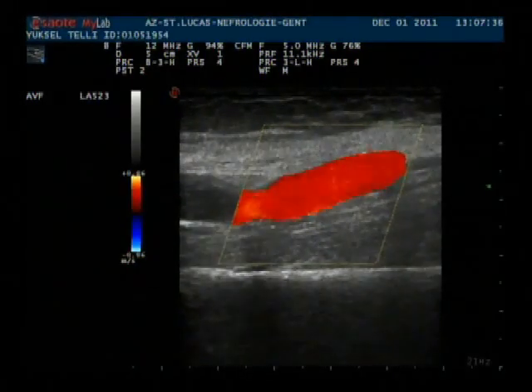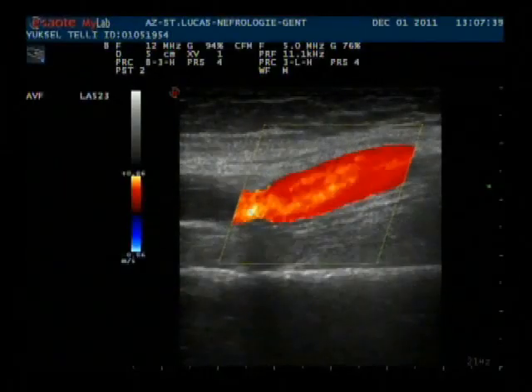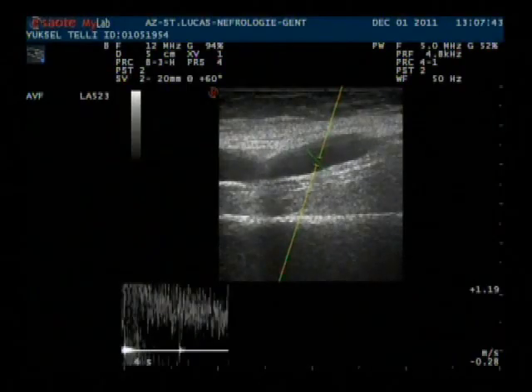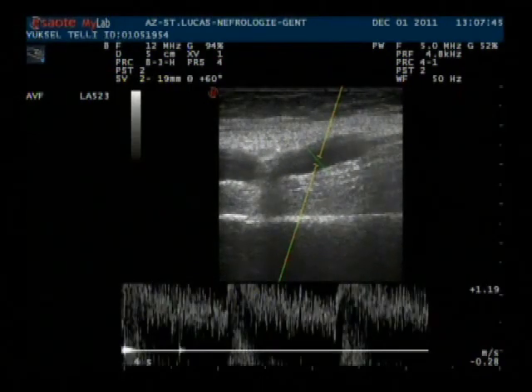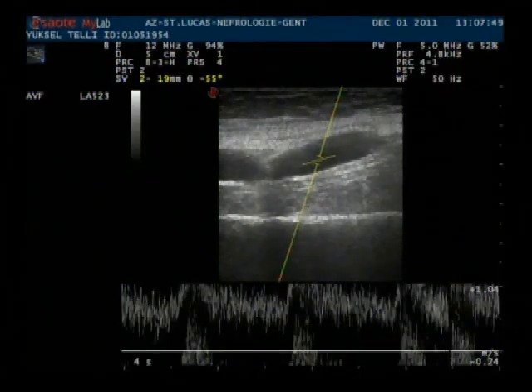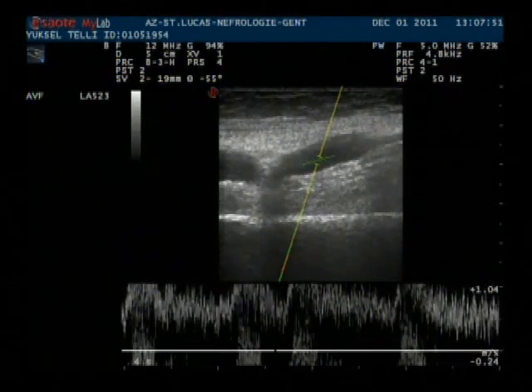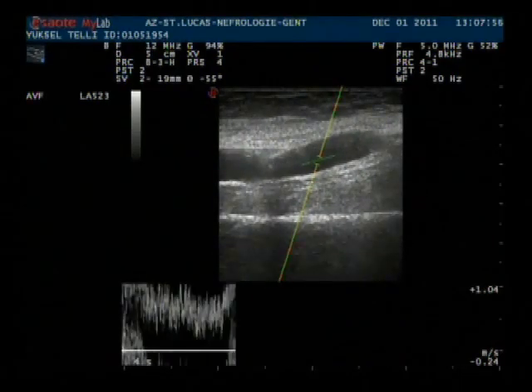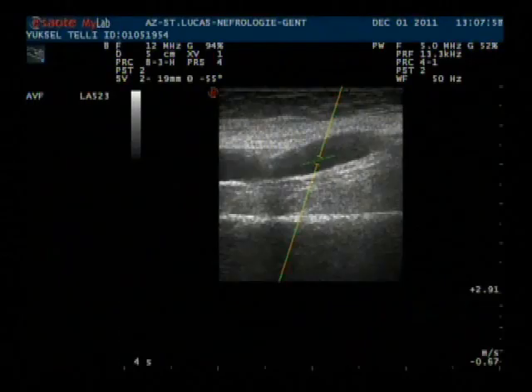On ultrasonography, here we visualize the brachial artery and we see a nice laminar flow within the artery, and we measure the flow through the fistula in this portion of the brachial artery just prior to the AV anastomosis. We have to increase the scale because we see aliasing.